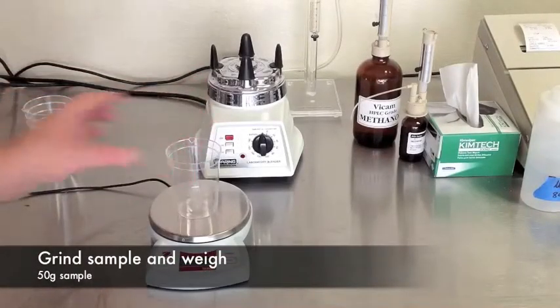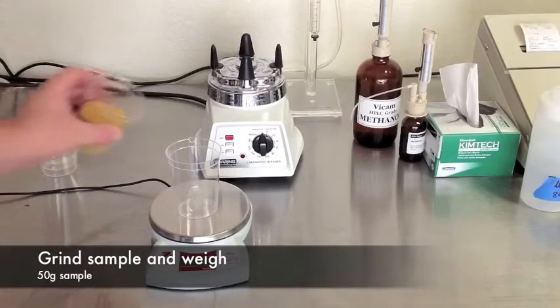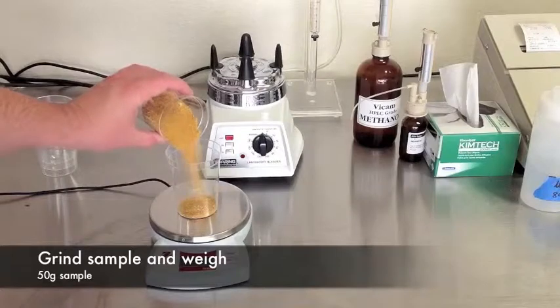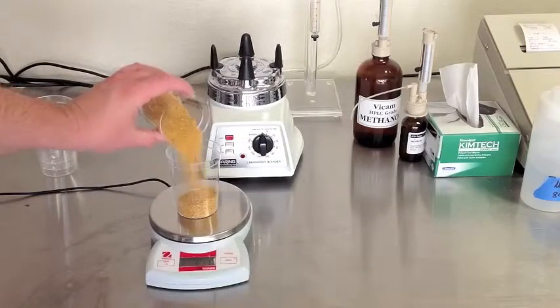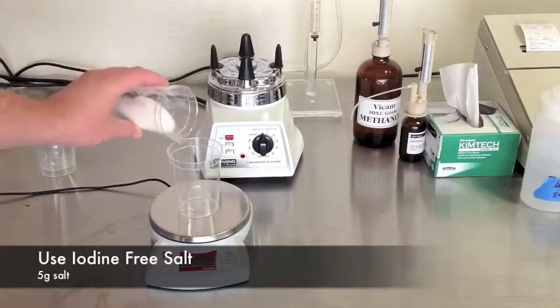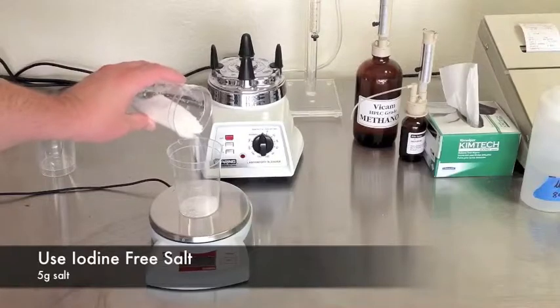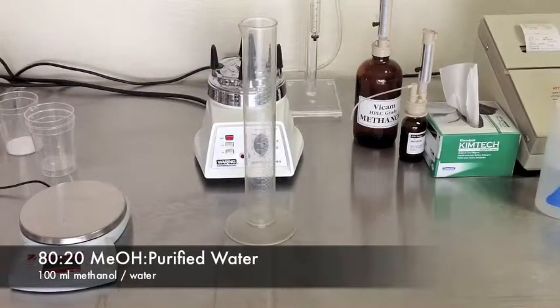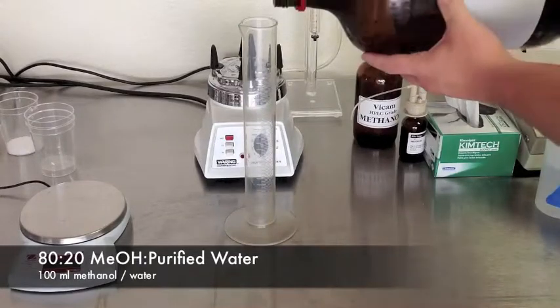First, grind your sample. A slightly coarse grind like you'd use in a drip coffee maker is appropriate. Measure 50 grams. Next, measure 5 grams of iodine-free salt. Measure 100 milliliters of 80-20 methanol and water.